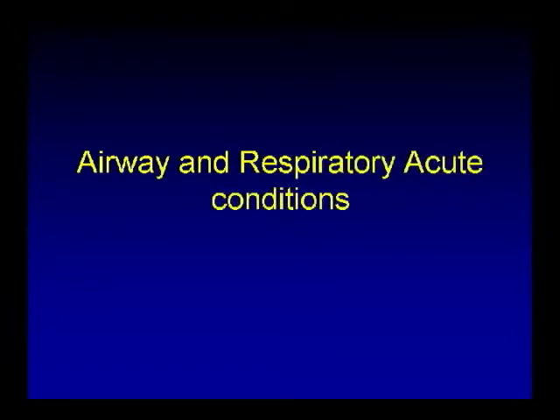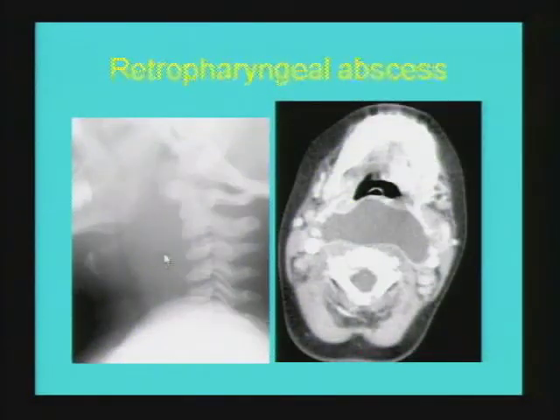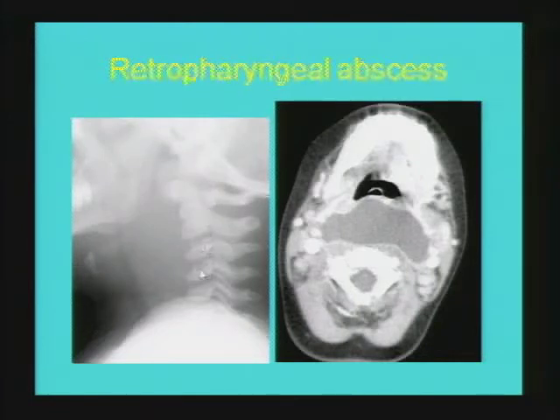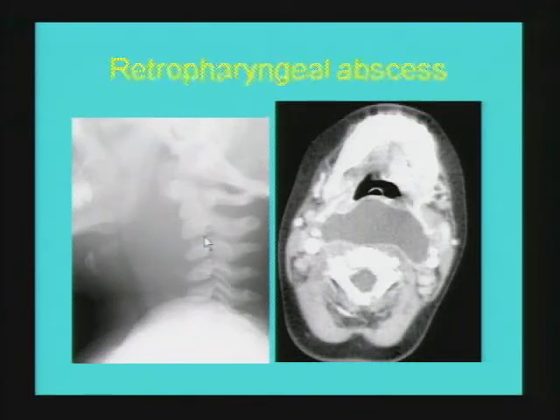Moving forward to acute airway and respiratory conditions — some of these cases were already covered in a prior lecture. This is a classical example of retropharyngeal abscess with exuberant prevertebral soft tissue forming a convex anterior margin. Note the alignment of the cervical vertebral bodies: not only is there loss of normal cervical lordosis, but there is actual reversal of the cervical spinal curvature, a helpful sign to differentiate redundant from inflammatory retropharyngeal soft tissue.